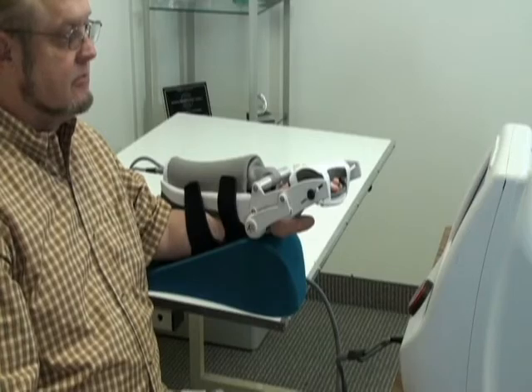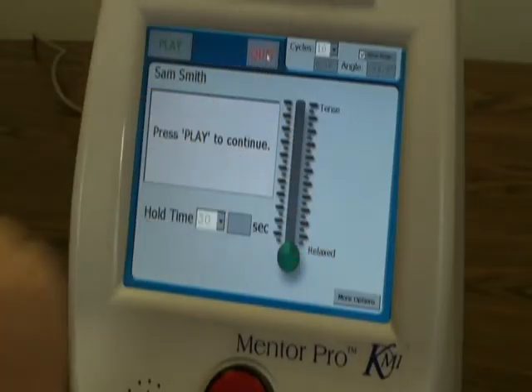See the other videos in this series to learn about the other types of programs for the hand mentor and foot mentor.